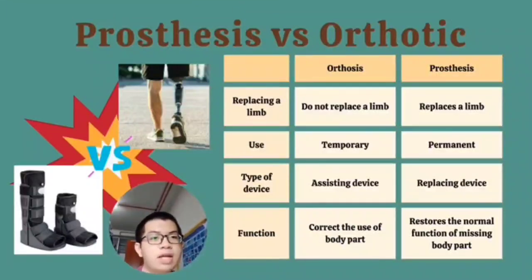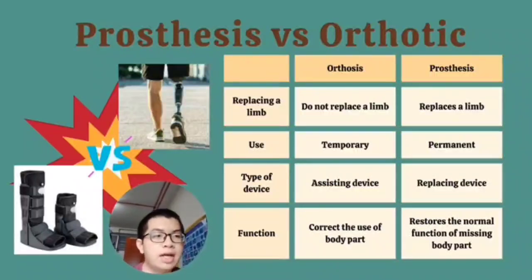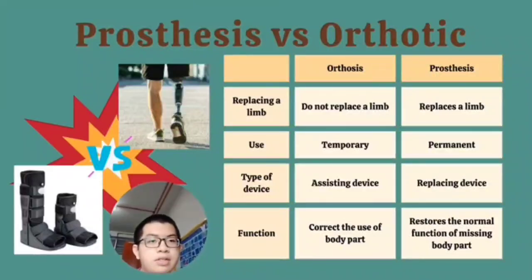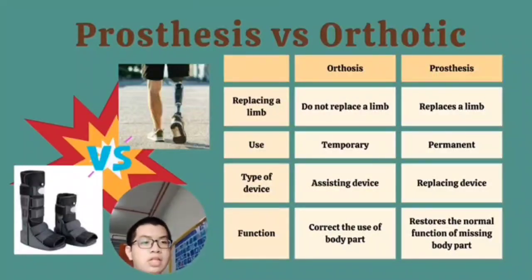The key factor that differentiates prosthesis from orthosis is that orthosis is a medical device used to correct a part of the body, while prosthesis is a medical device which helps to replace a lost part of the body, especially a limb. Besides that, prosthesis helps to restore a particular body function by making an artificial limb using computer-aided systems. Meanwhile, orthosis treats patients with a brace to enhance quality and effect. Lastly, prosthesis is a permanent device while orthosis is a temporary device, which supports the skeletal, muscle or nervous system without replacing any part of the body.